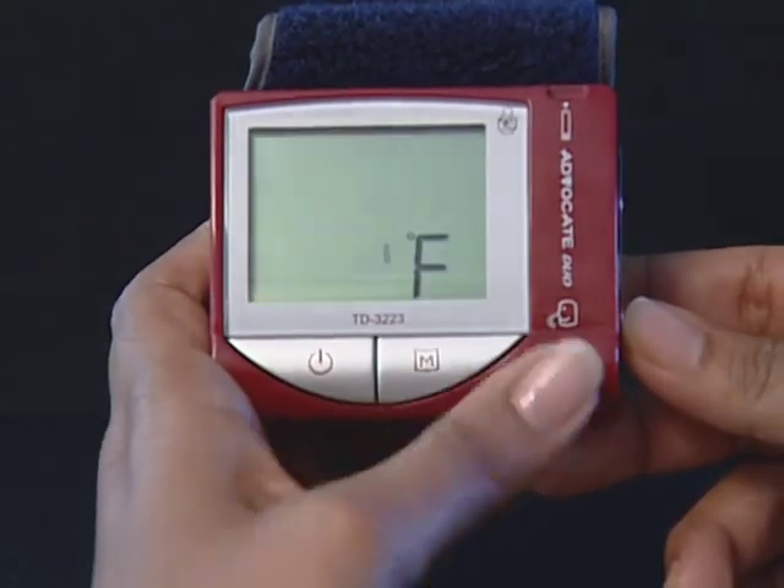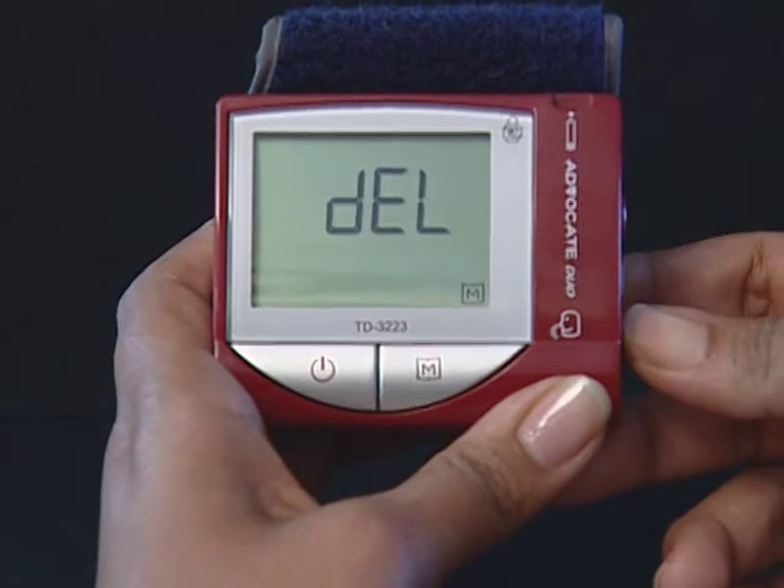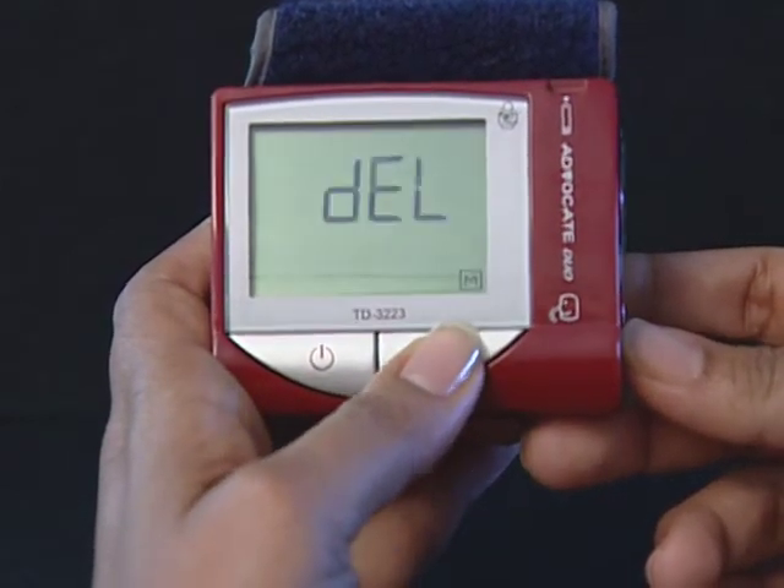Select C degrees for centigrade or F degrees for Fahrenheit. Press and release the M button to select the unit of temperature you want to use. Press the set button and the meter will display DEL with the flashing M symbol.